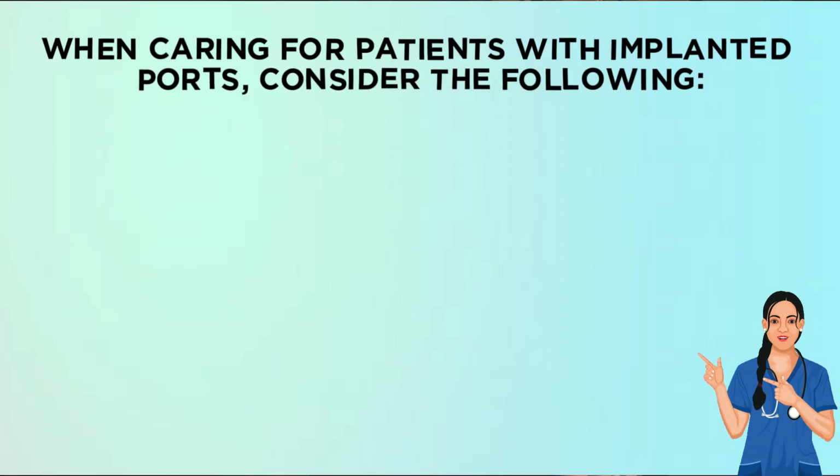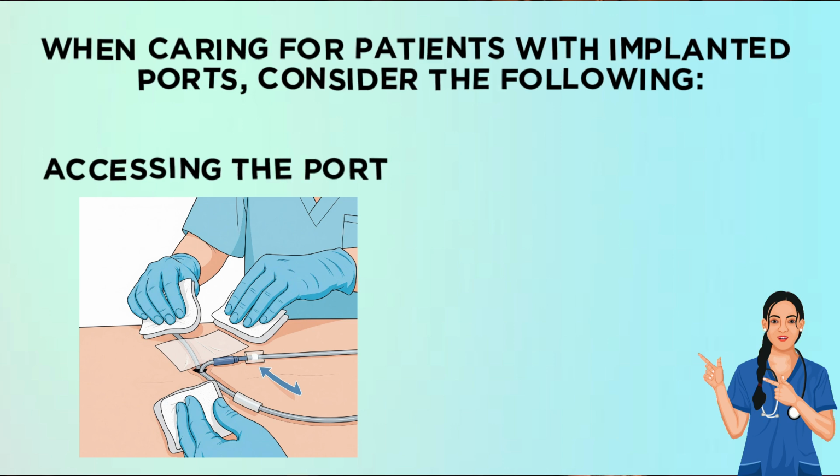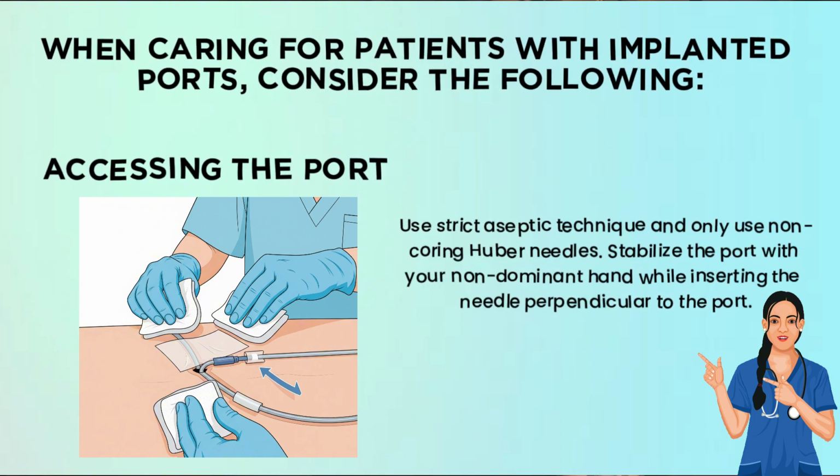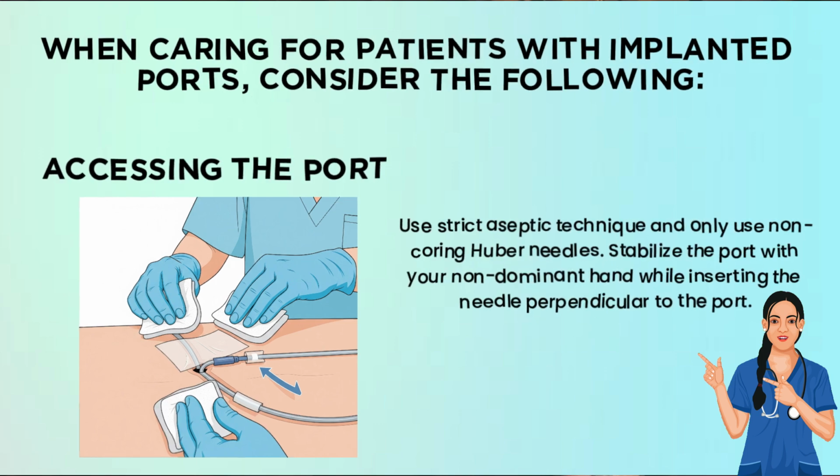When caring for patients with implanted ports, consider the following. Accessing the port. Use strict aseptic technique and only use non-coring Huber needles. Stabilize the port with your non-dominant hand while inserting the needle perpendicular to the port.